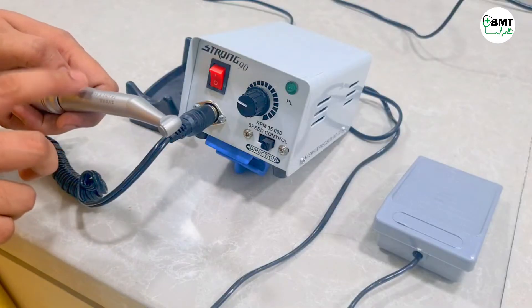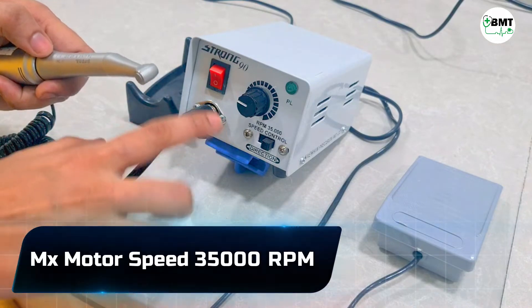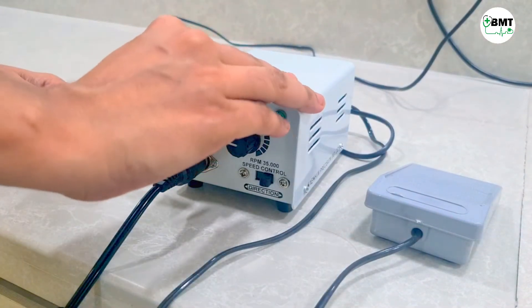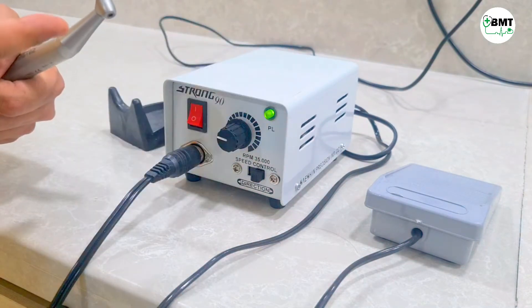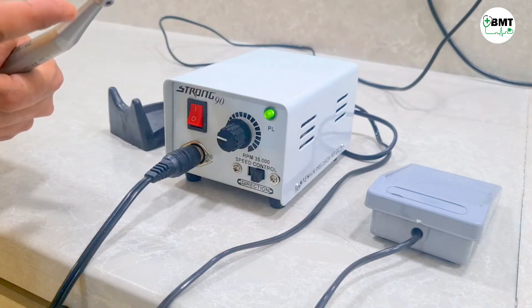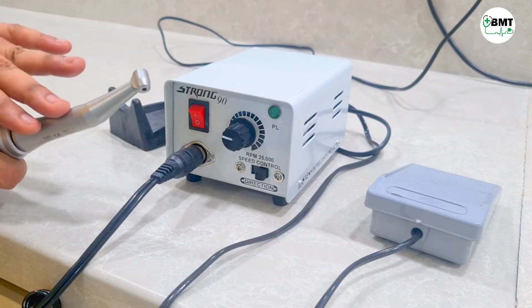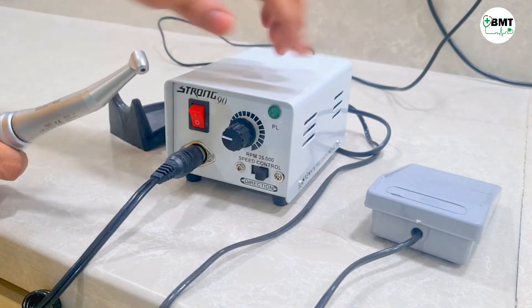Let us see how this handpiece functions — this cable is for the handpiece. To operate, you connect a drill bit, which is used during root canal. There are two modes in which this handpiece can be operated: one is continuous mode and the other is through the foot switch.